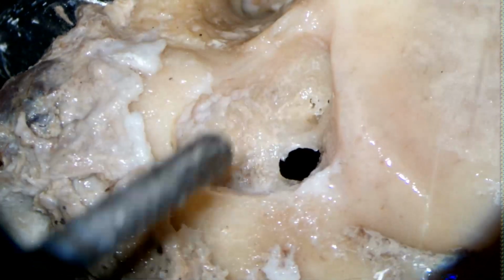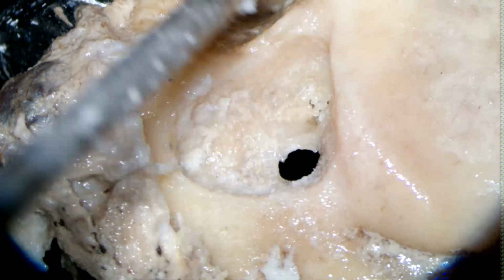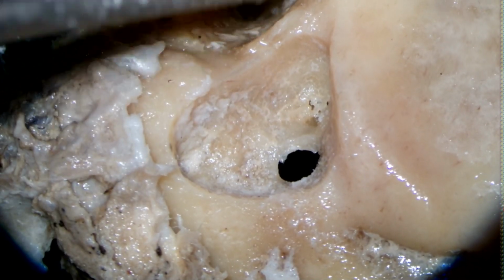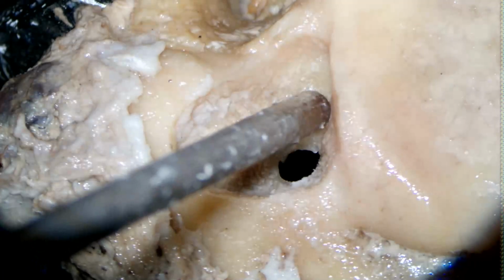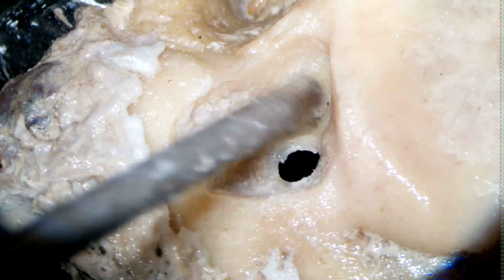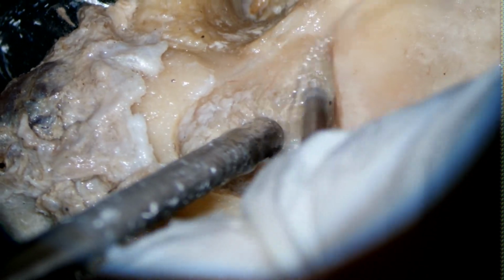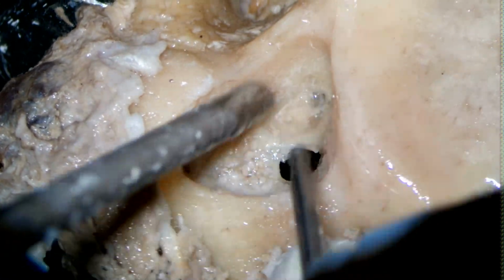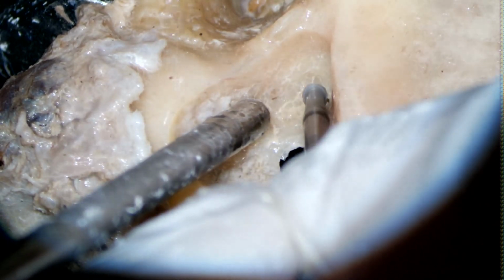So you can actually see the depth of the middle layer also, right? And then compare the amount of drilling which you have done in the antrum. Okay, so probably this is the antrum which we have now.